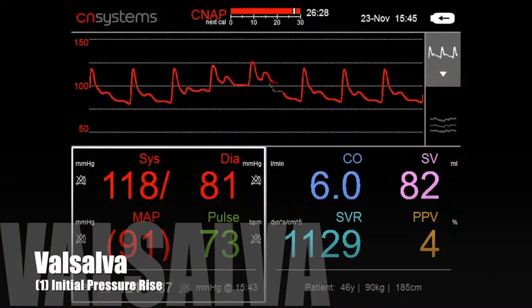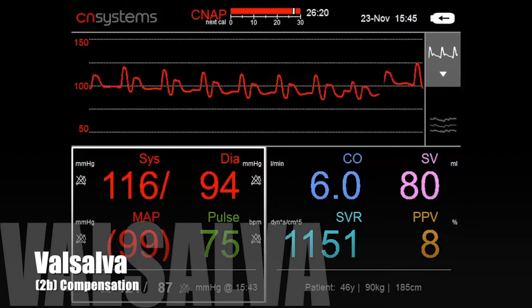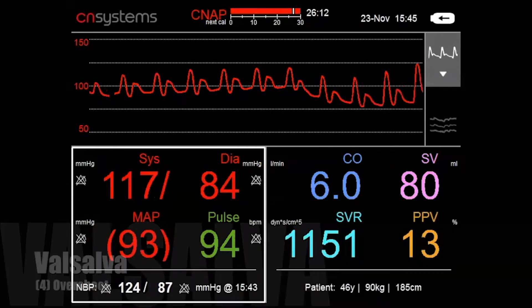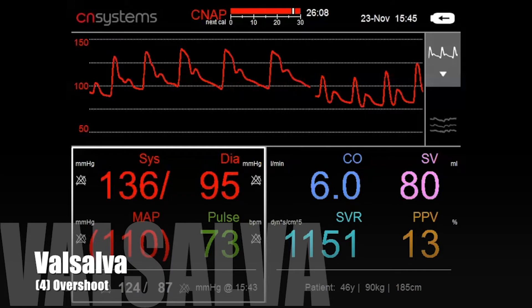A perfect example to demonstrate the performance of the NIBP100DHD is the Valsalva maneuver, where the subject takes a deep breath and tries to exhale against closed mouth and nose. The NIBP100DHD accurately tracks cardiovascular responses of blood pressure and pulse rate, allowing recording of continuous real-time data during fast hemodynamic changes.